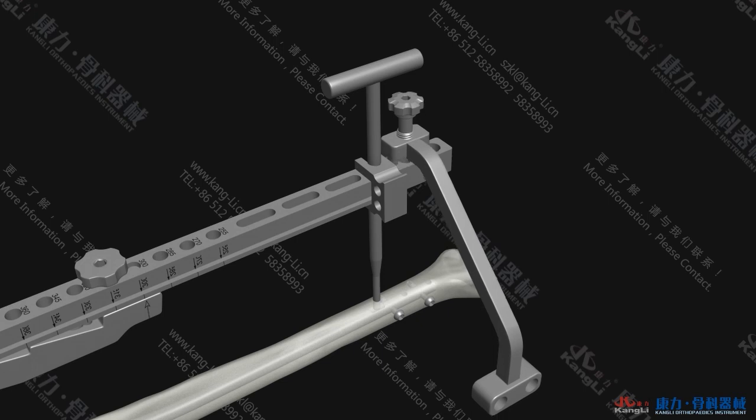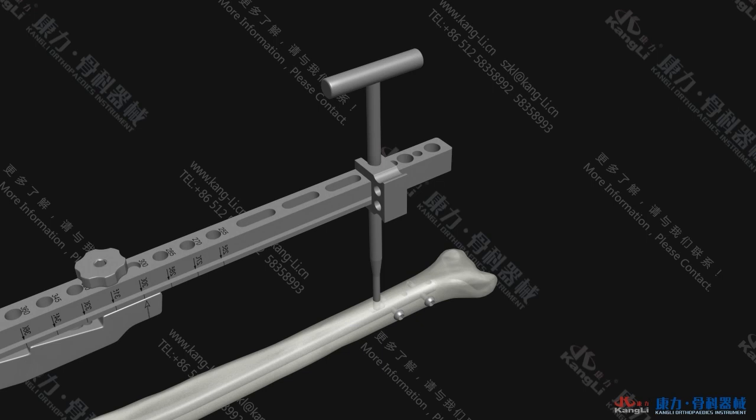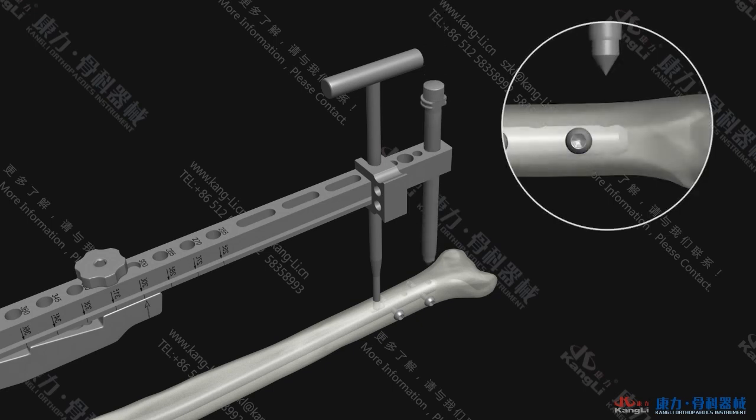The third and fourth 4.5 locking screws could be placed at the front or rear of the nail of KTO Tibial Intramedullary nailing system according to the requirements by the type of the fracture. The operation should be performed as follows. Insert the soft tissue separator and outer sleeve at the front and rear position of the distal end of the guide bar. After a 0.5 cm long incision is made right under, continue inserting the soft tissue separator and outer sleeve until bone cortex is reached. Remove the soft tissue separator. Insert 4.0 inner sleeve and 4.0 pin to drill.